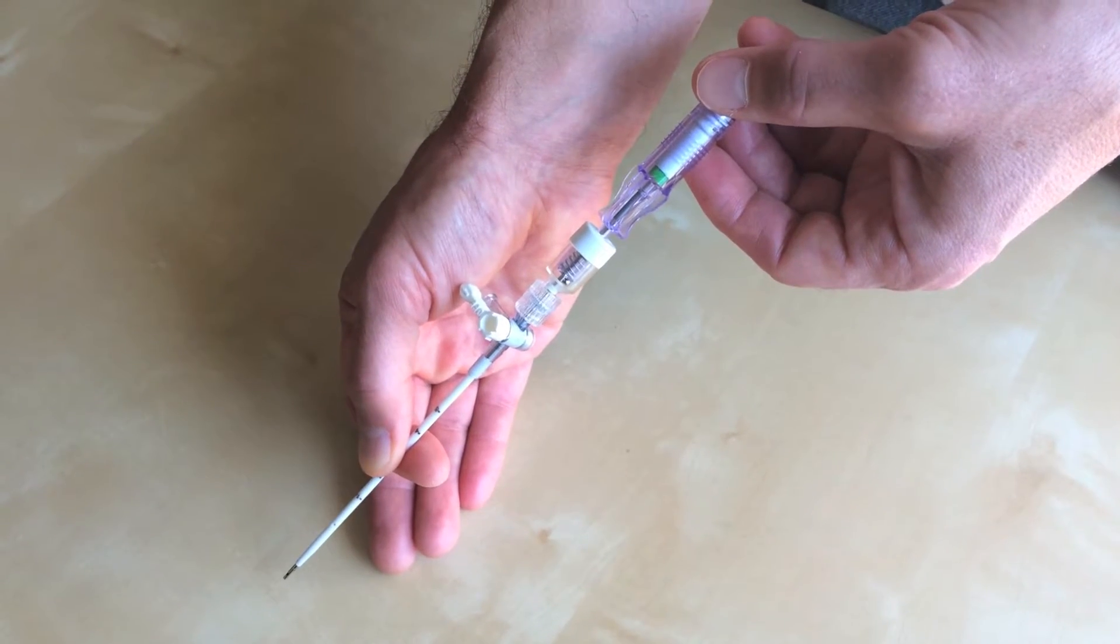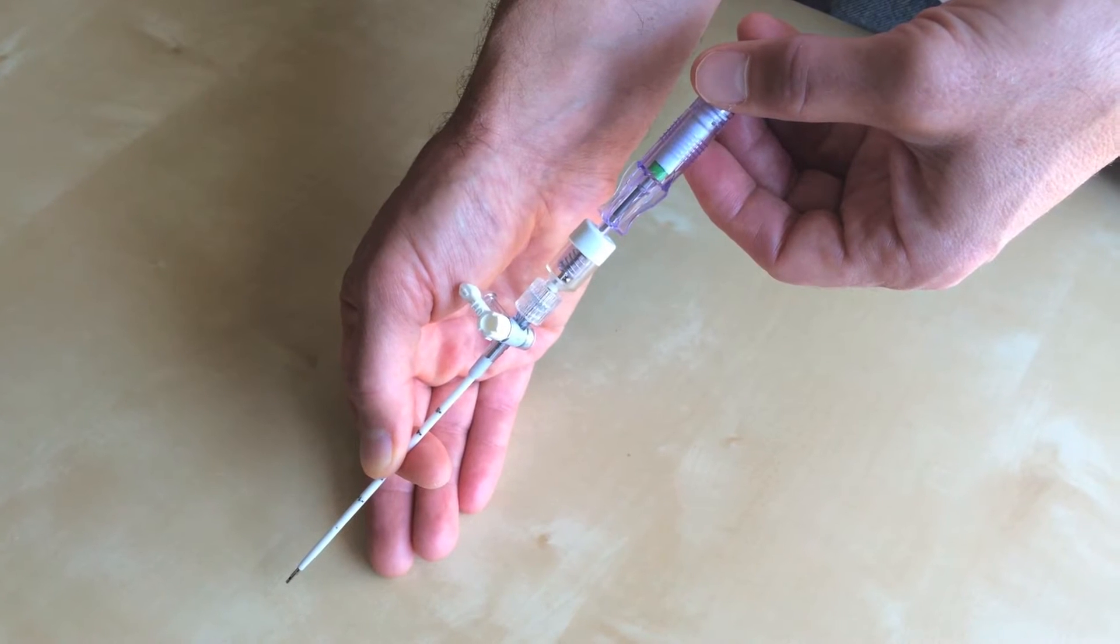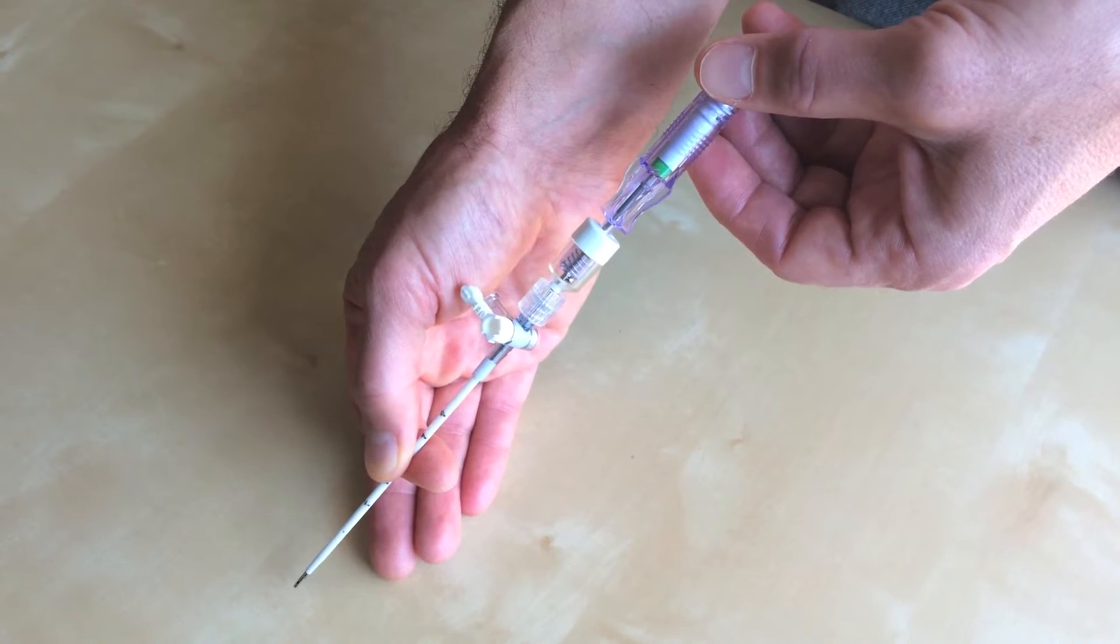The Turcal needle is an 8 French catheter over needle system with a blunt retractable tip for decreasing the risk of bowel injury.